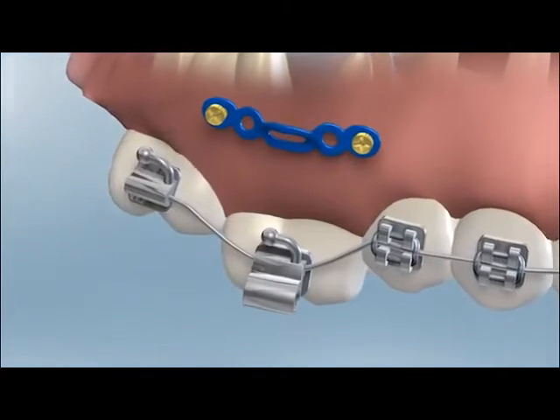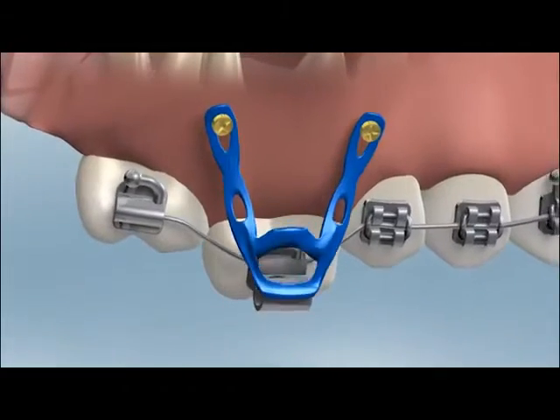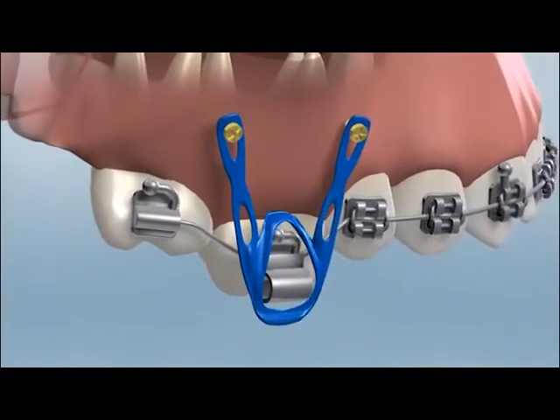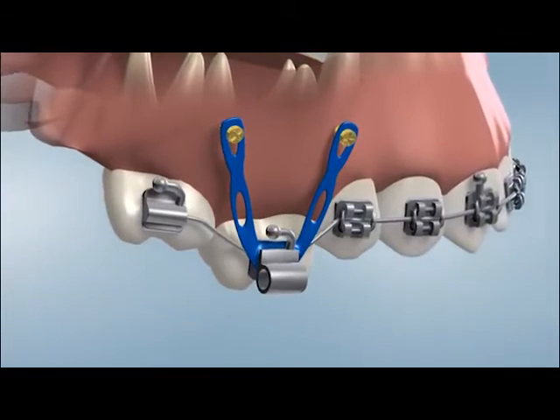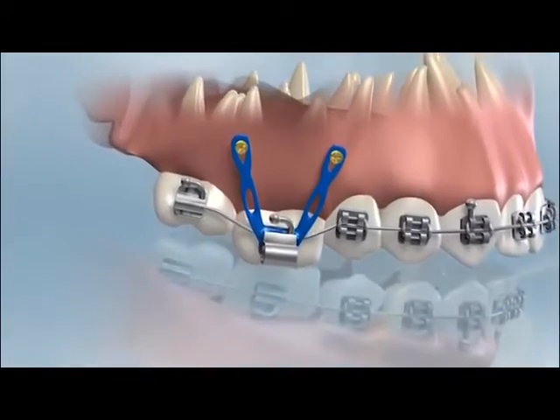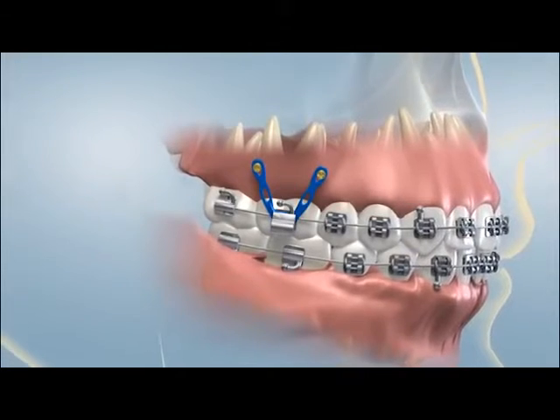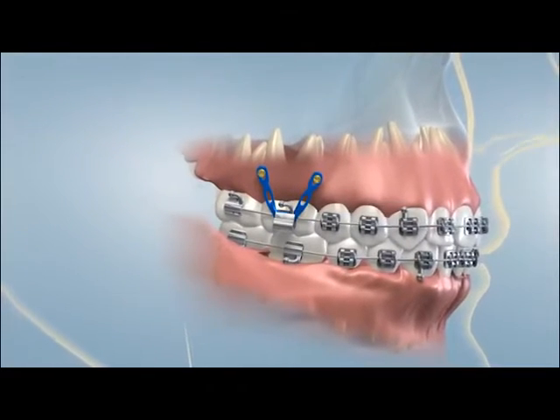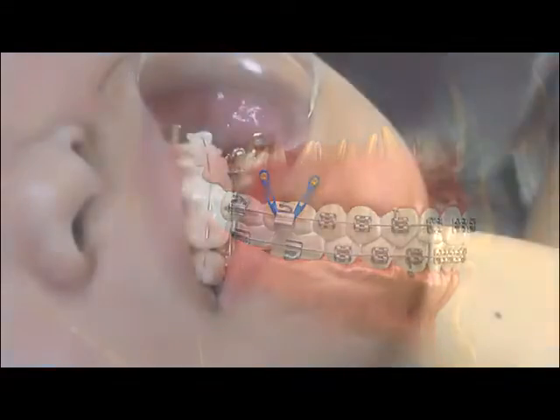The benefit of a TAD is based on the basic law of physics. We know that for every action, there is an equal and opposite reaction. In the mouth, when we put a spring or rubber bands between the teeth, they both will tend to move. The ability for the teeth to move through bone over time is what allows us to move teeth with orthodontics. A TAD is placed so that the orthodontist can design a customized tooth-moving pressure system.